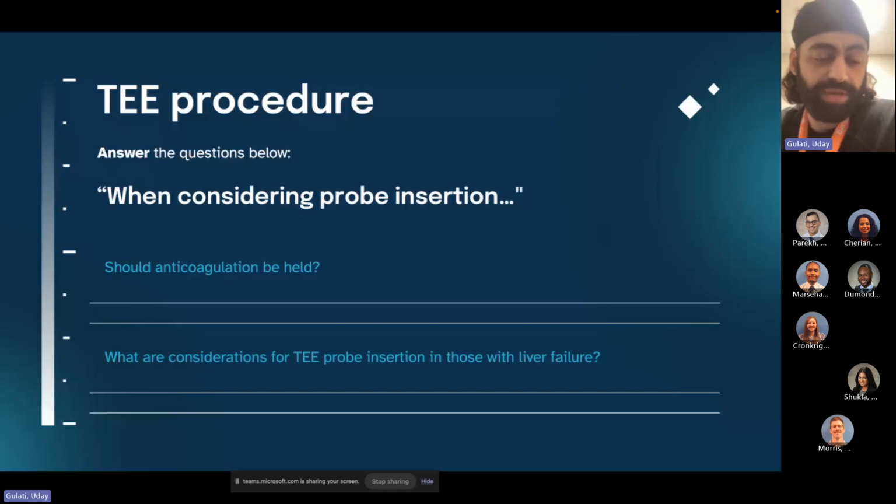And then if they take a look and it looks good, you can go. Or what they can potentially do is have you do the procedure with them in the room, and so if there are any complications, they can intervene and take a look as well.